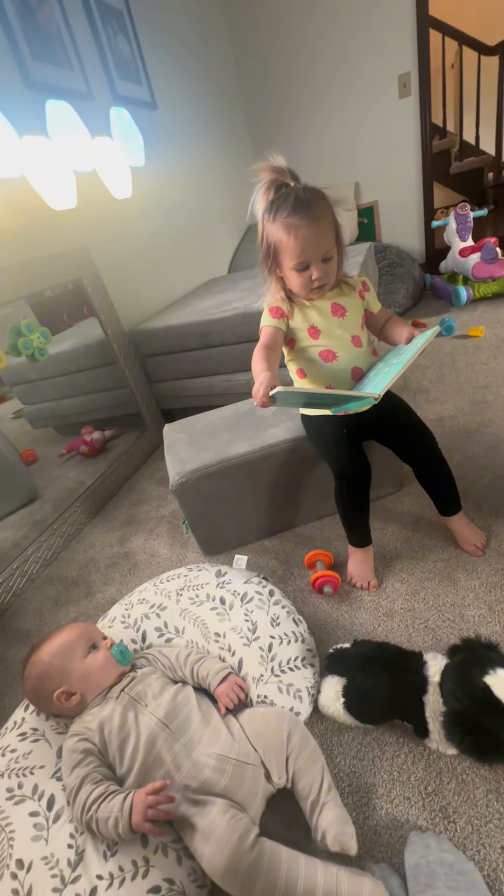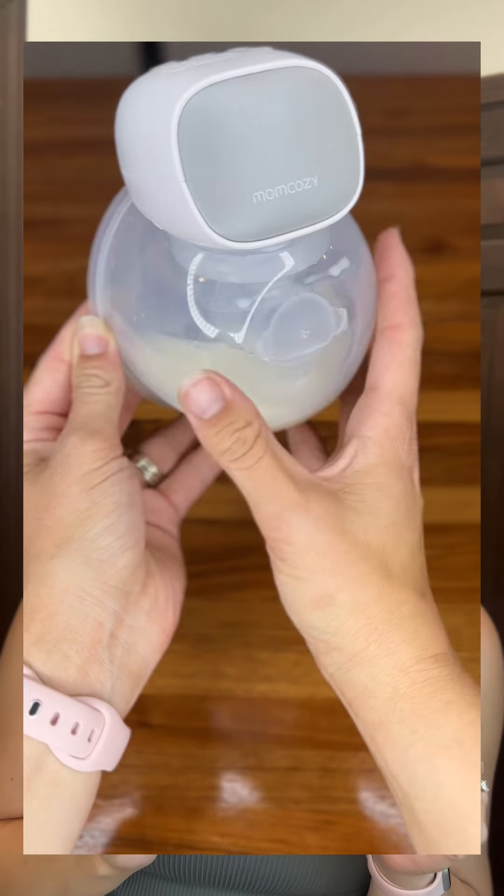If you're an exclusive pumping mama like me, you know that there's tons of breast pumps to choose from. Hey, I'm Holly. I'm a mom of 2, I'm an exclusive pumper, and I'm part of the What to Expect community, and I'm going to tell you all about the Mom Cozy S9 Pro.